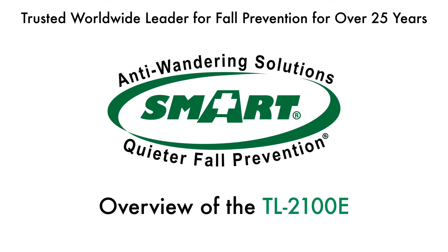Welcome to the overview of the TL2100E monitor by Smart Caregiver, the trusted worldwide leader for fall prevention for over 25 years.